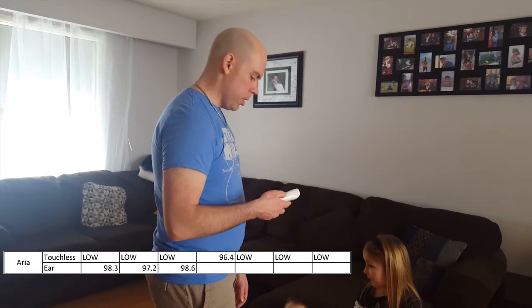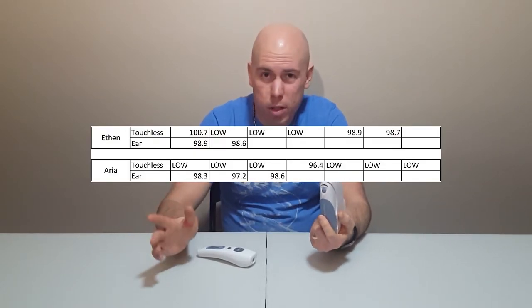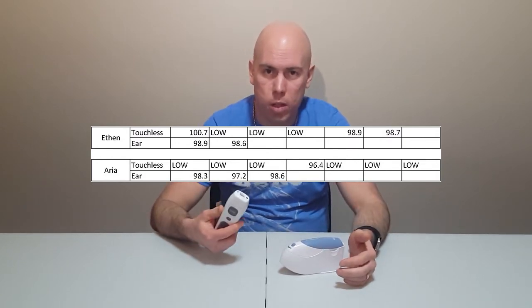Looking at the numbers, the in-ear thermometer is a lot more consistent than the touchless one. That doesn't necessarily mean the touchless one isn't accurate — it just means it didn't work consistently compared to the in-ear model. Infrared and forehead thermometers aren't new; there have been infrared thermometers for many years, and even as a child there were forehead temperature strips where color change indicated temperature. Measuring temperature from the forehead is not uncommon, though it's not as accurate as going in your ear.